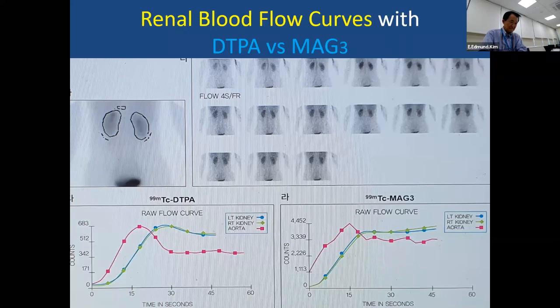Most centers I visited do not prepare such an optimal preparation, for the convenience of the patient, but that will make for inadequate curve analysis.